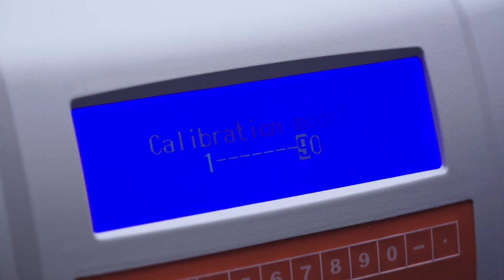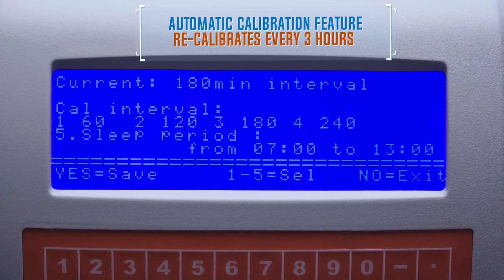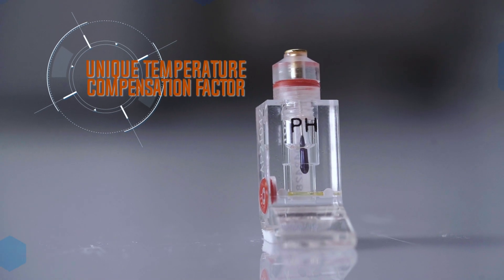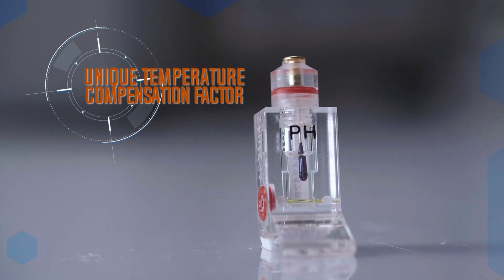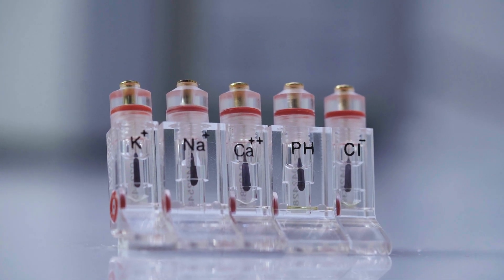The automatic calibration feature calibrates the system every 3 hours or as manually set. A unique temperature compensation factor compensates for any variation in pH caused by temperature fluctuations.